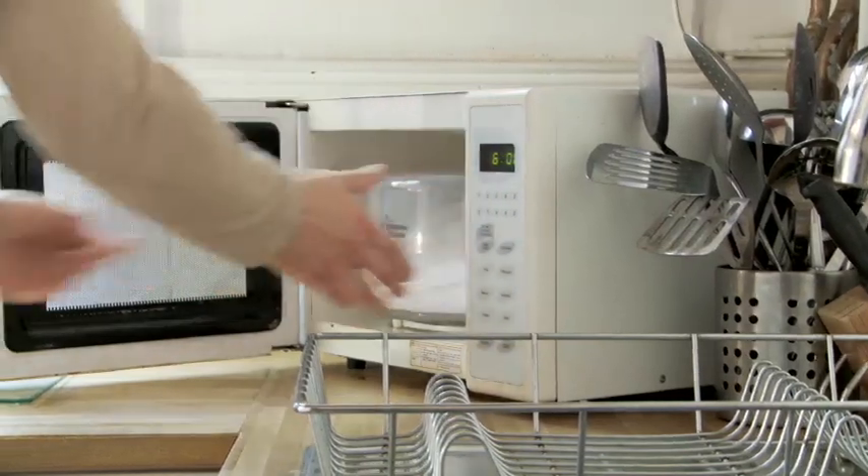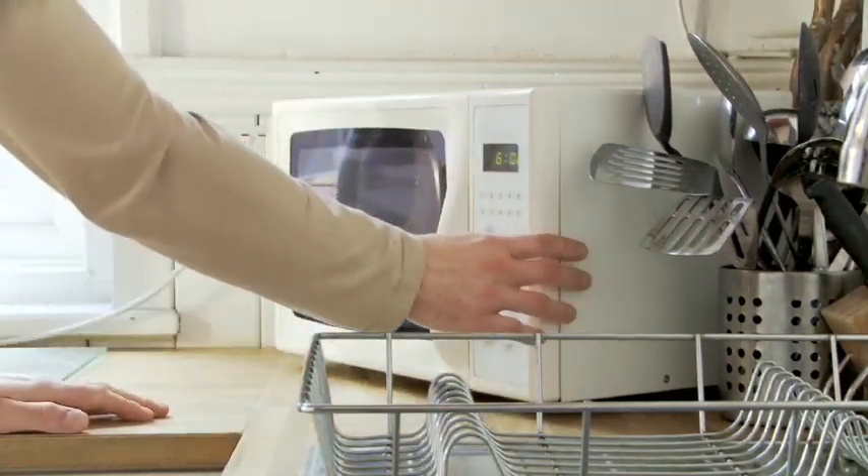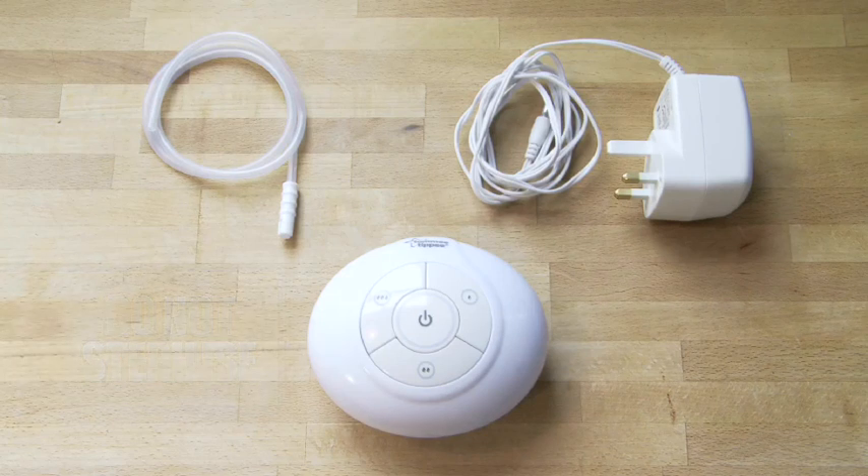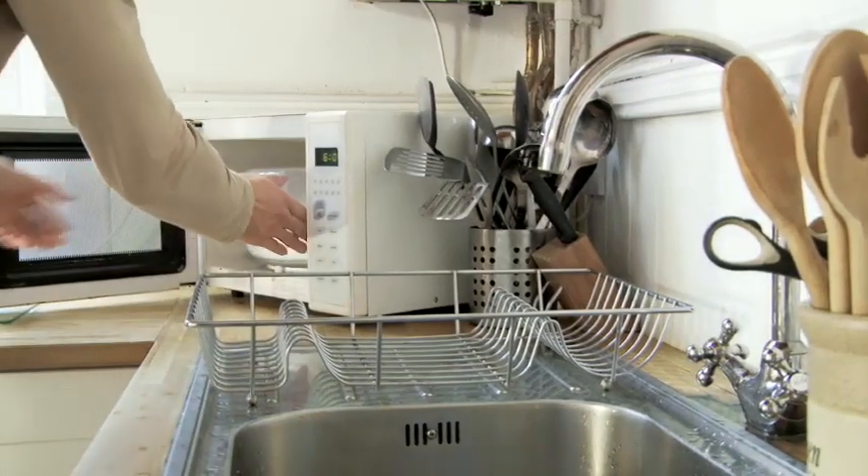When you sterilise your pump, bear in mind that three components should never be sterilised: the air tube, motor and mains power adapter. Inadvertently sterilising these parts can render them unusable.